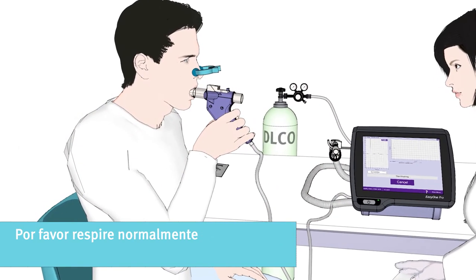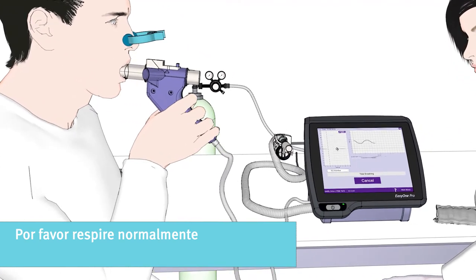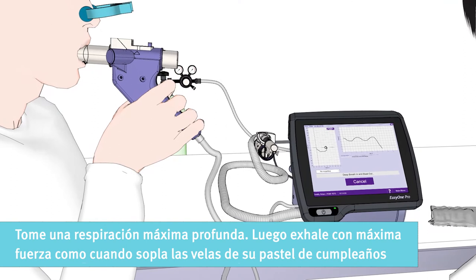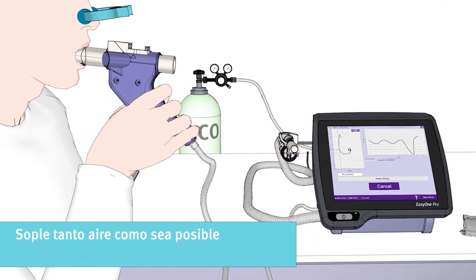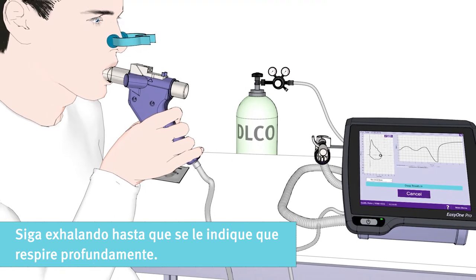Now please breathe normally in the beginning. Then take a maximum deep breath. And then exhale with maximum force, like blowing out candles on a birthday cake. You must blow out as much air as possible. Keep on exhaling until you are instructed to take a deep breath in.